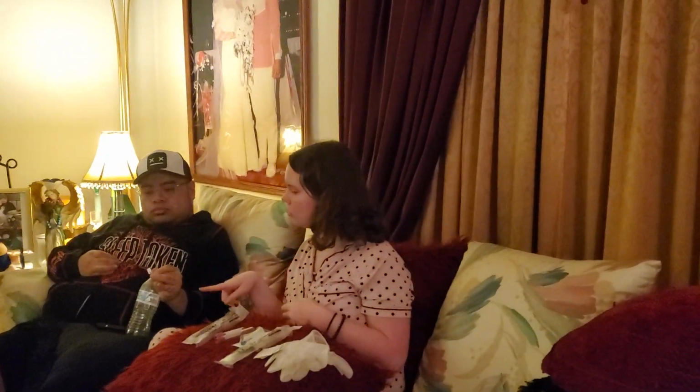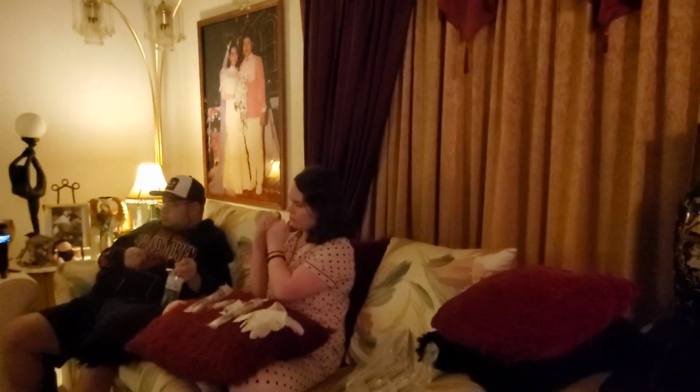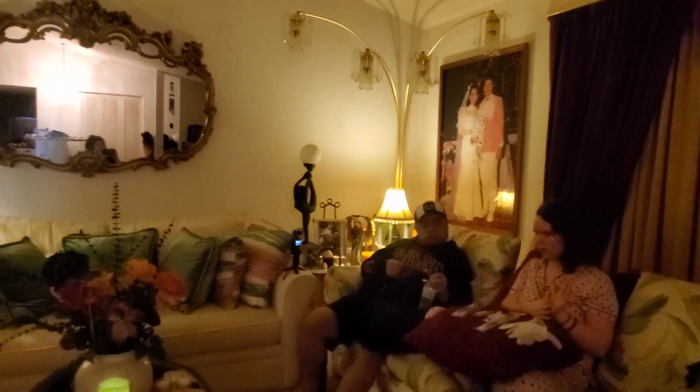I provide privacy. I'm going to do my 2 identifiers. Can you give me your name and your date of birth? September 49. Do you have any allergies? No. Perfect, thank you. I scan my patient, check and make sure I have the right patient. Hand hygiene. For a CVAD, we have to do a pre and a post assessment.